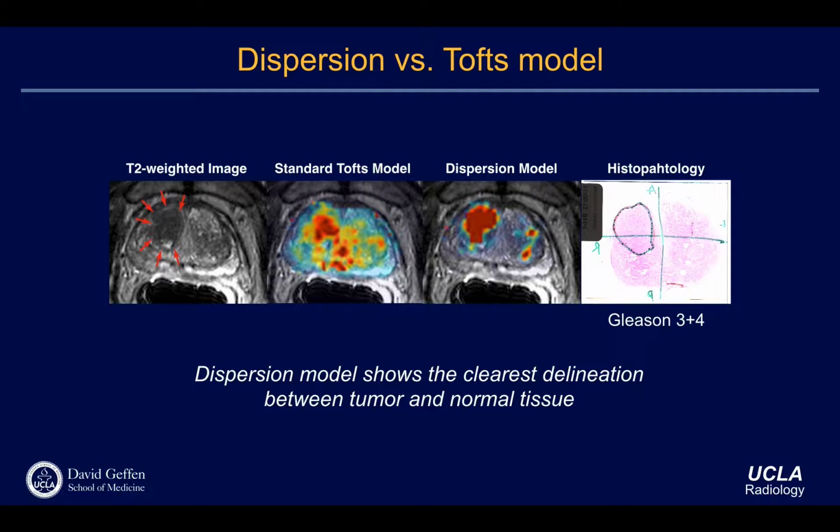So there's some complexity included, but I think the bottom line is people assume that those differences will be lower than actual K-trans differences. So even though there are subtle differences, you can still capture the huge differences between a fast uptake versus slow uptake. But if you really want to look at longitudinal studies and drug responses, those very careful quantification numbers, including the considerations of that heterogeneous AIF across patients and across different tissue types is very, very important. Does it make sense? Any questions so far?